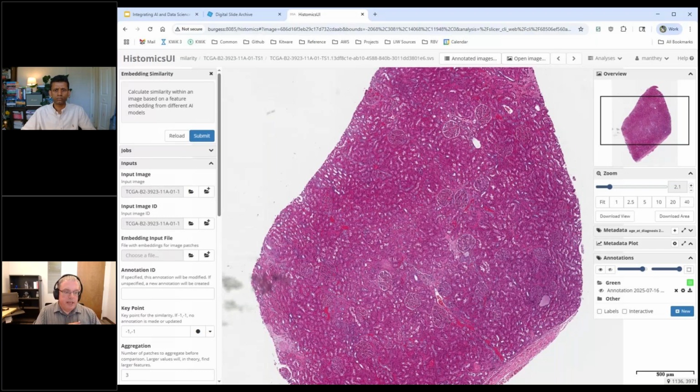So this key point is a set of coordinates, X and Y. This is something that every workflow that's going to use these has to have this rich metadata. And so if you're familiar with command line tools, it gives you a little bit of metadata. We need more to actually do these things well and hook them up. And so this is the process that we have.